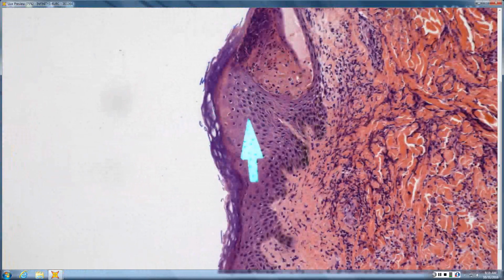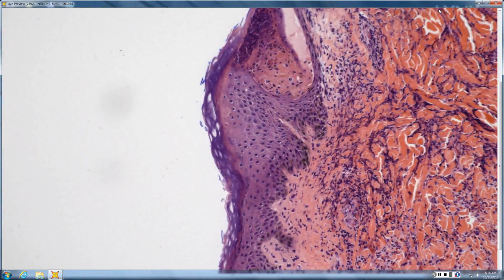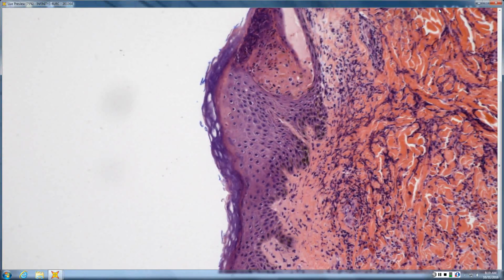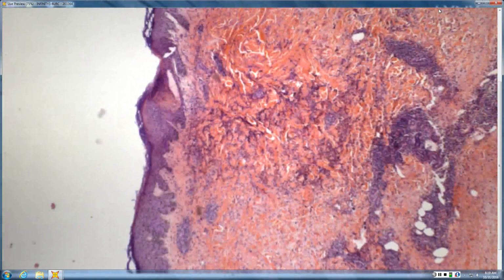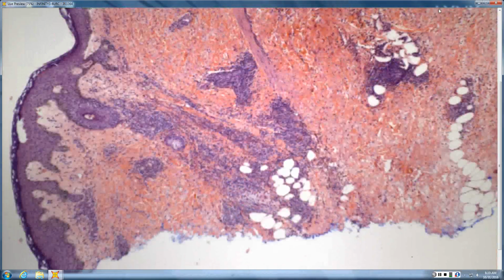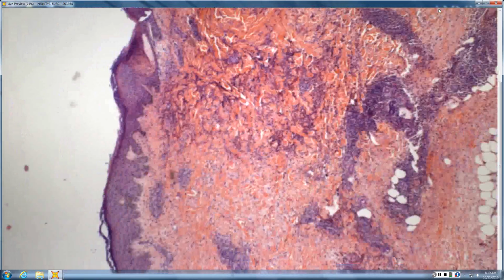And in the epidermis, there's a chunk of serum, death. Yeah, I mean, crud. Okay, so it's a cruddy epidermis, and you've got vasculitis, and you've got lots and lots of eos, as you said, and it's superficial and deep.